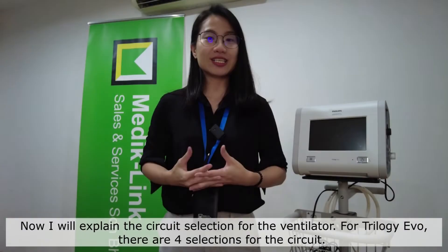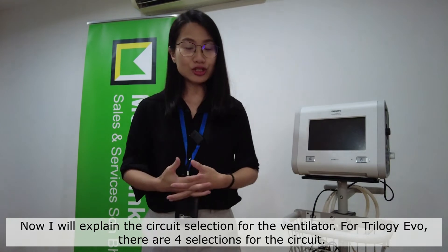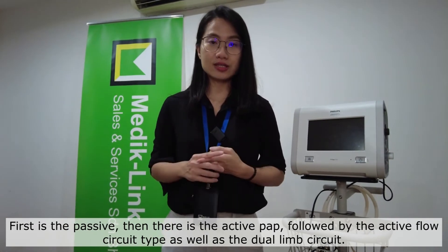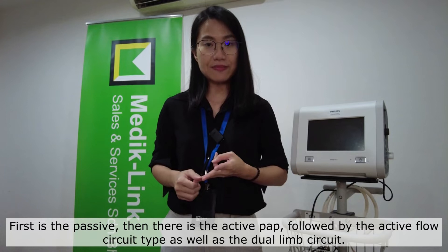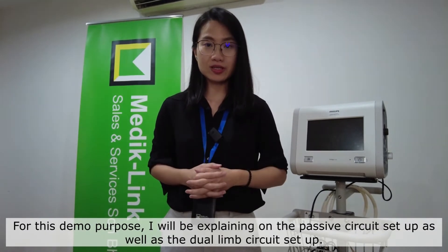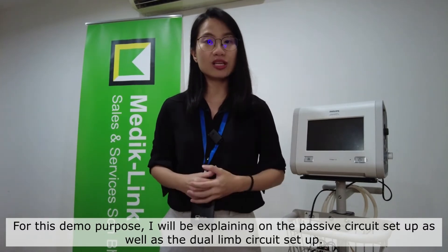Now I will explain the circuit selections for the ventilator. For the Trilogy EV300, there are four selections: first is the passive, then there is the active PAP, followed by the active flow circuit type as well as the dual limb circuit. For this demo, I will be explaining the passive circuit setup as well as the dual limb circuit setup.